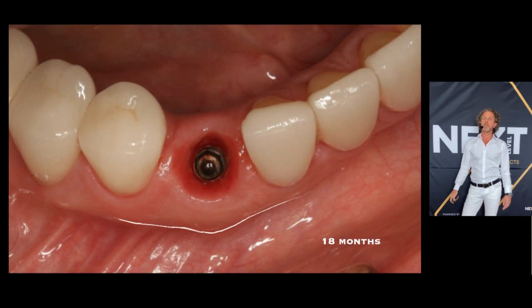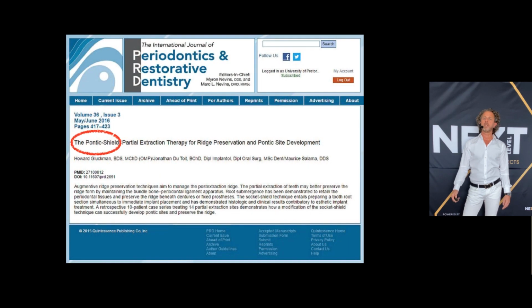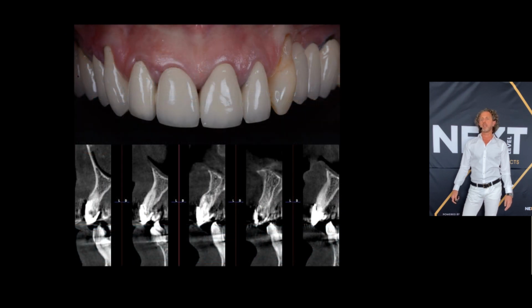It's 18 months, and look at the tissue profile and tissue thickness with no tissue loss at 18 months. Okay, the second variation is a pontic shield. Just look at this case.